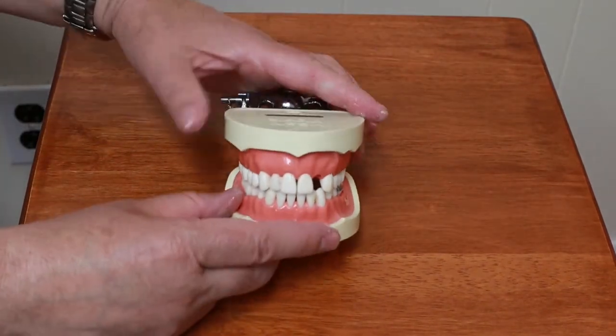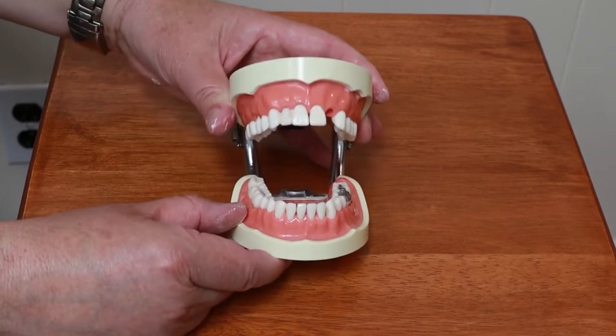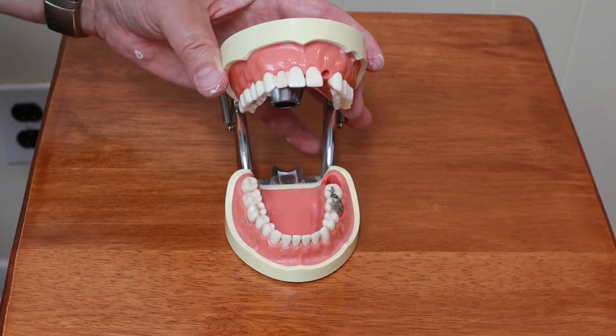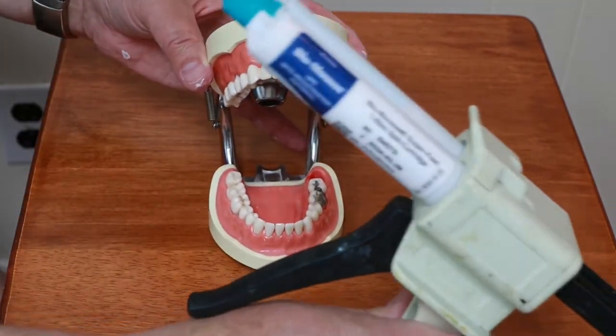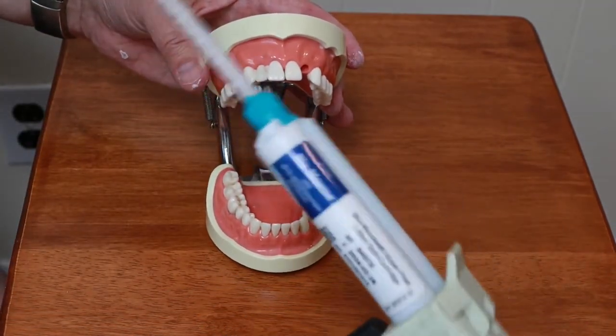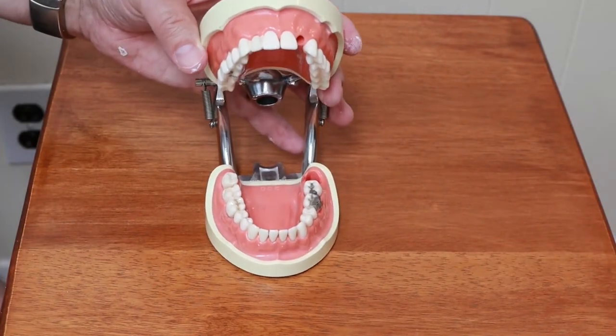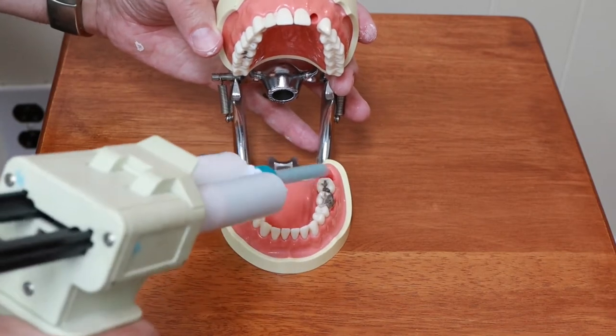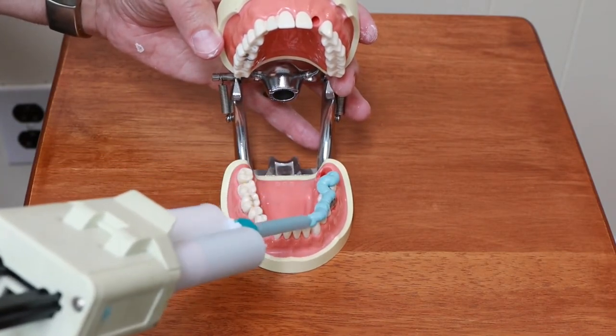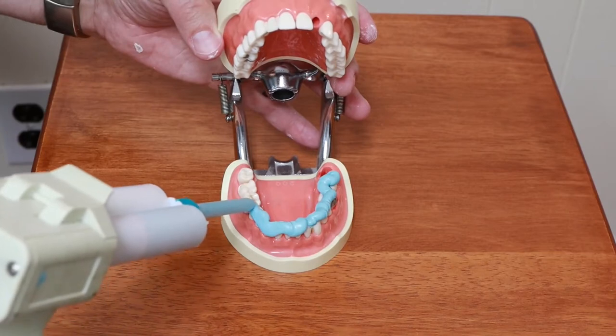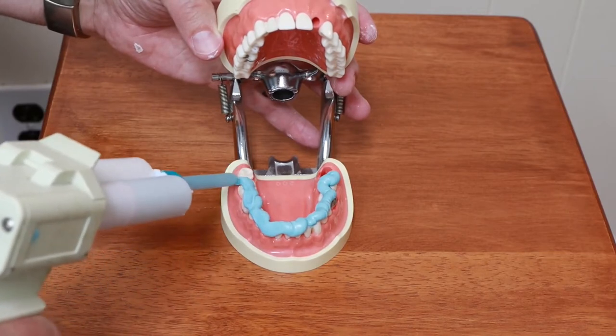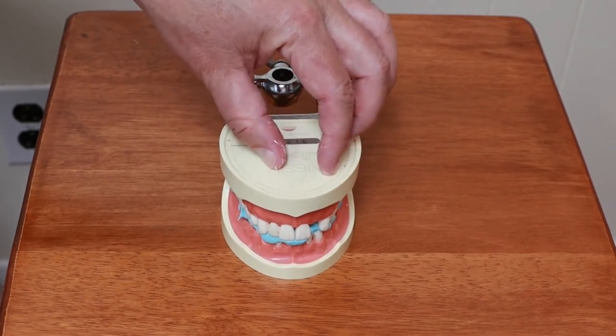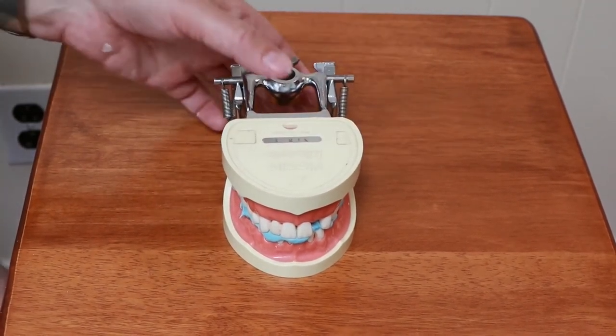Last thing that we got to do is take a bite registration. Basically I'm just going to squirt some material called blue mousse. It comes in the cartridge again. This is similar to that first impression material except it's a lot stiffer. I just run a bead of the blue mousse across the biting surfaces of all the teeth. And then we just have Buster close down, bite down into it. The blue mousse takes about a minute to set.